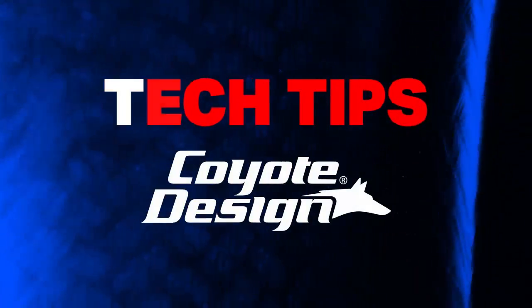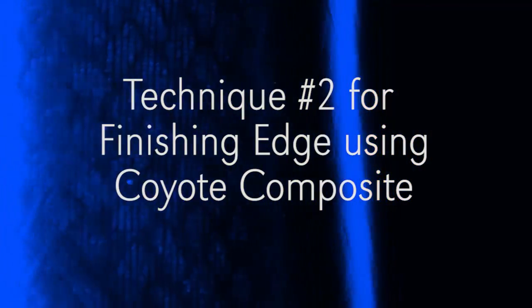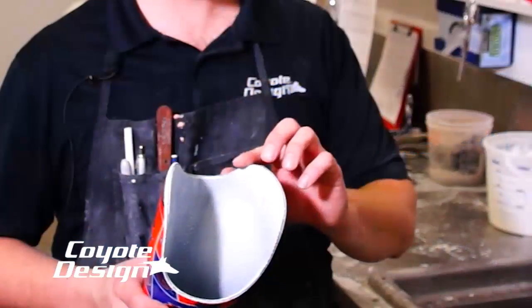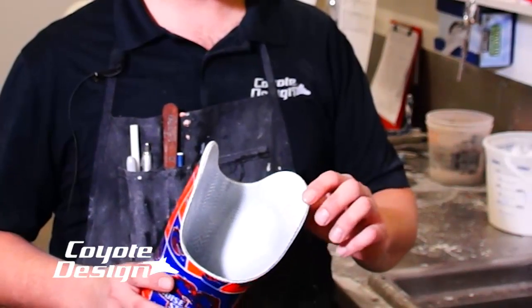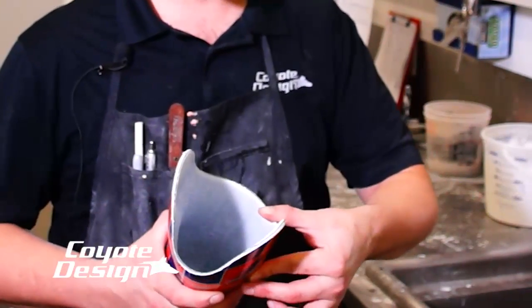Tech Tips from Coyote Design. One of the concerns with laminating coyote composites is the finished edge that you get. It actually finishes better than carbon sockets I've done in the past — those tend to stay really jagged.